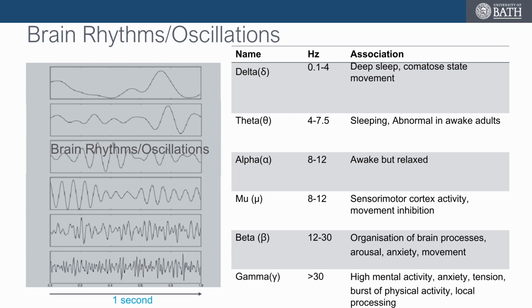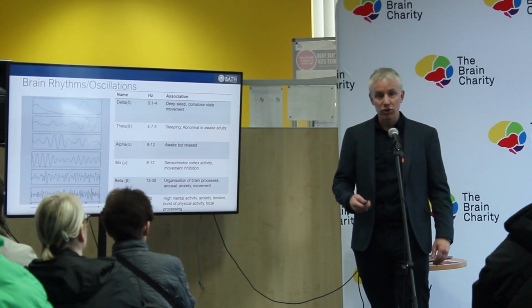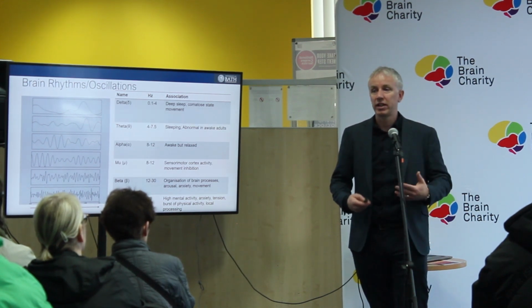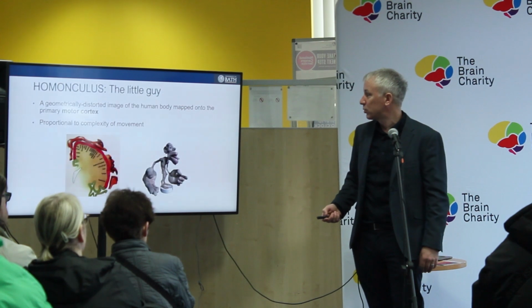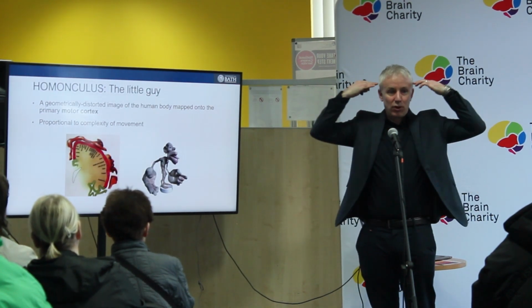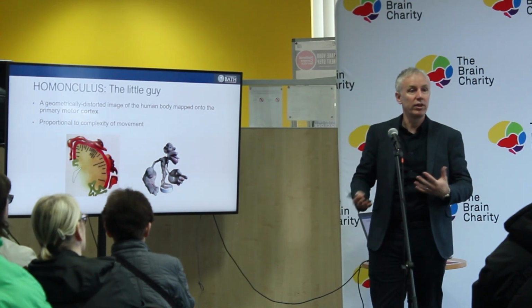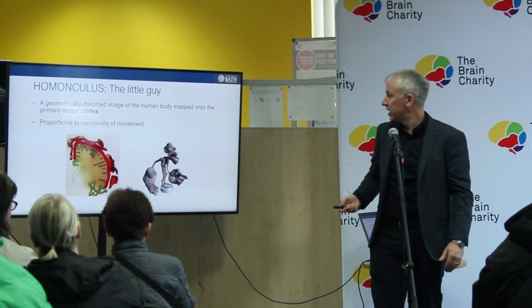So that's important. Brain-computer interfaces enable movement-independent communication. Just by imagining movement, you can change your brain activity, and then we can translate that into a control signal. The motor cortex is split up like this. Your tongue is here, hands here, feet here. So you know where to look for these signals and when they're going to change.